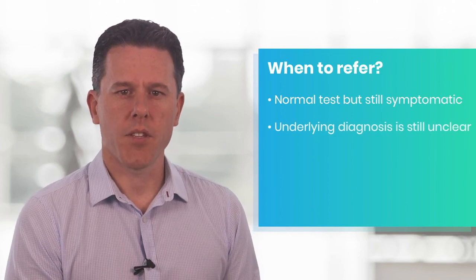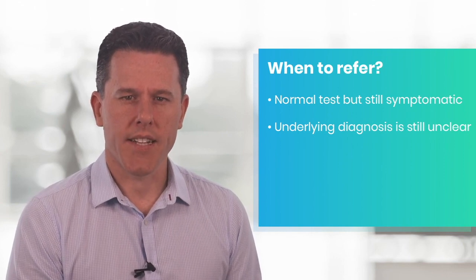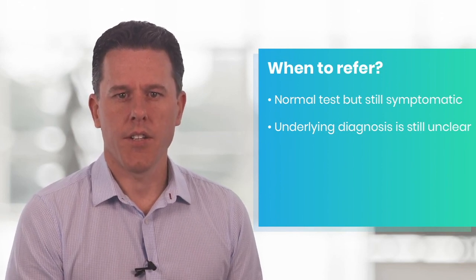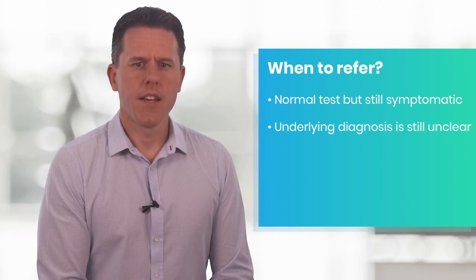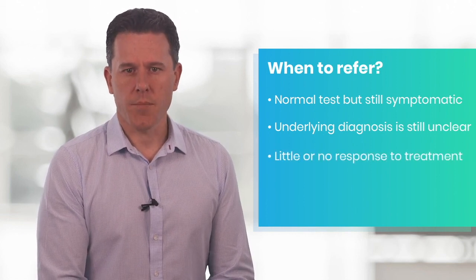And the benefit that we have in our respiratory labs is that we can do some more detailed testing, especially of gas transfer. And that can give us some additional information to help in the diagnosis of patients with respiratory symptoms.